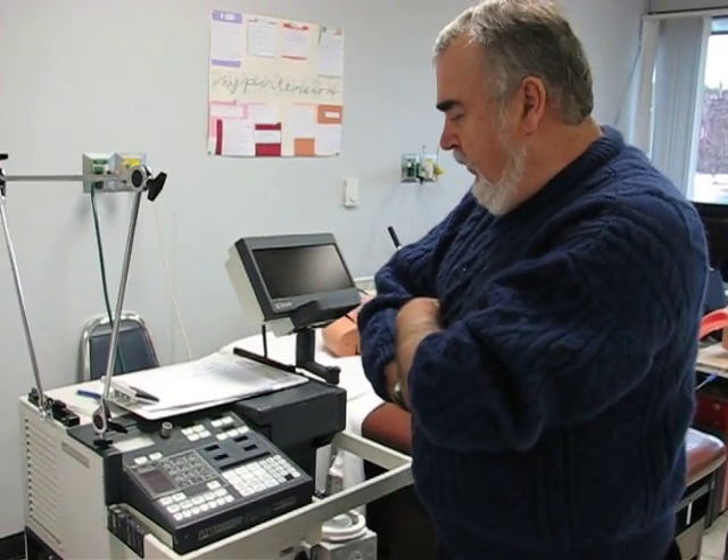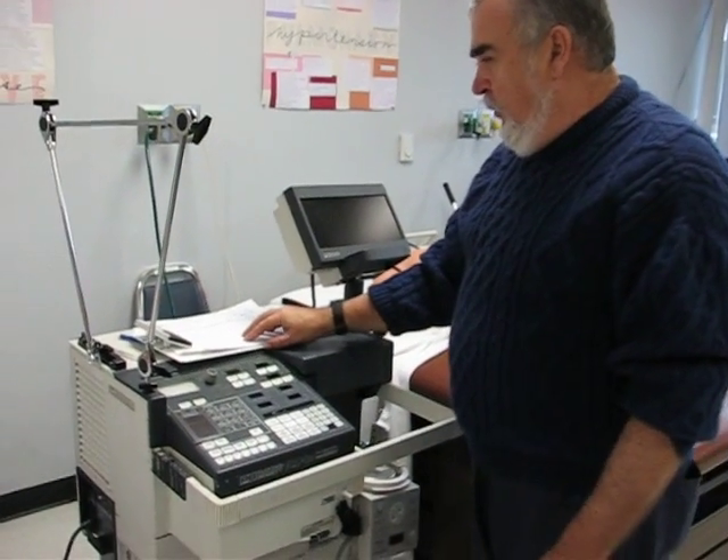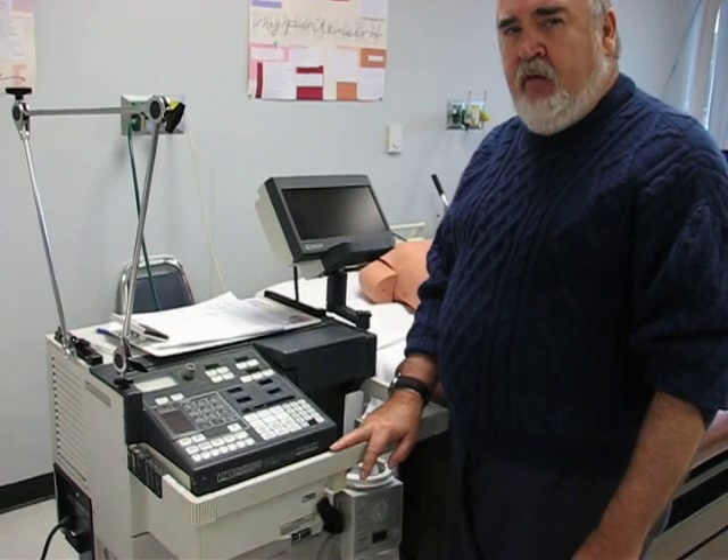This is the procedure for setting up the 7200 ventilator on a patient and making sure you have all the settings and all the alarms set accurately.